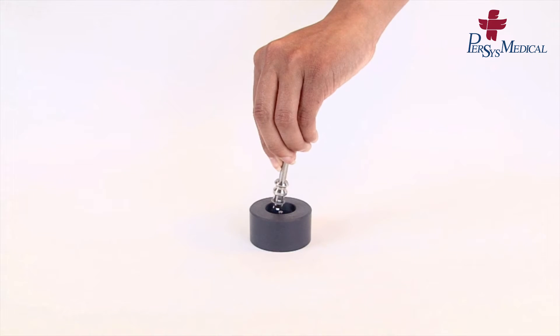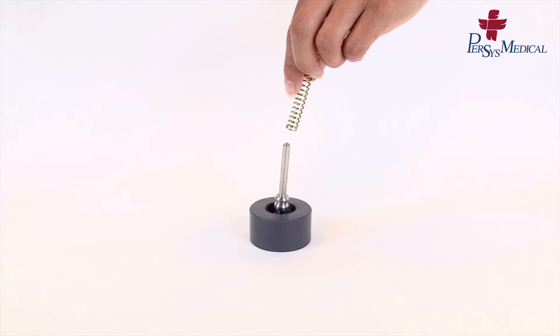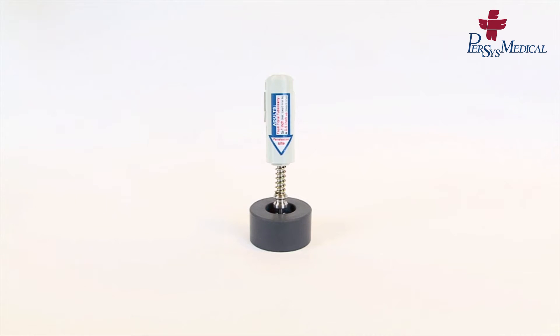Place the piston into the reloading base. Slide the spring onto the piston. Place the top barrel on top of the spring. Arrows should be pointed downwards.